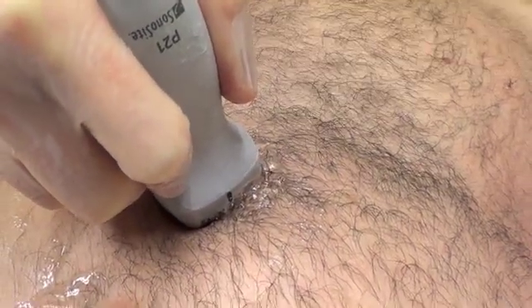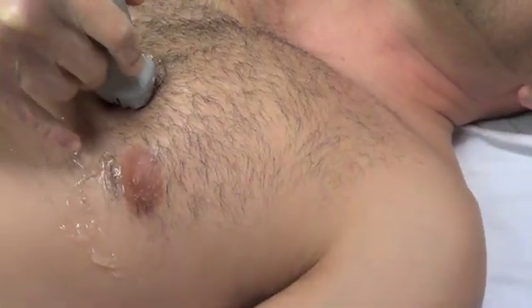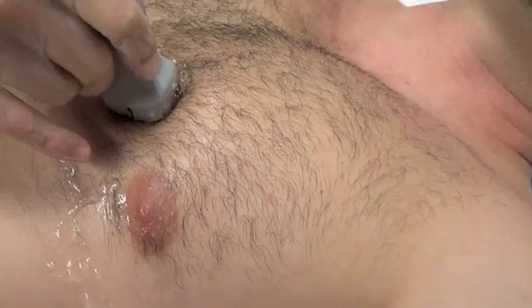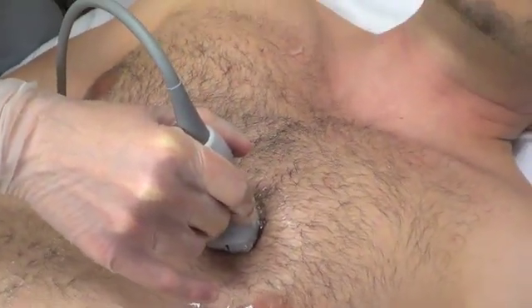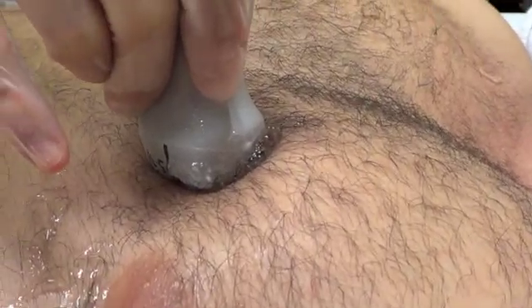Once we have that view with the indicator towards the right shoulder, we rotate clockwise with the indicator towards the patient's left shoulder. This gives us the short axis view. When you turn for the short axis view, you're going to see the mitral valve — above it is atrium and below it is ventricle. If we're looking at the mitral valve, we tilt down towards the patient's left hip to get the papillary muscles in view. Once you have the papillaries in view, you're adequately in the mid left ventricle.